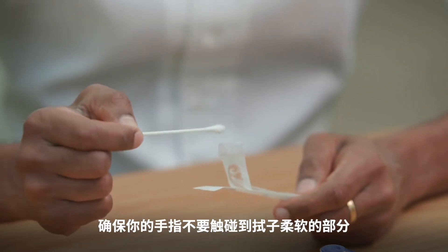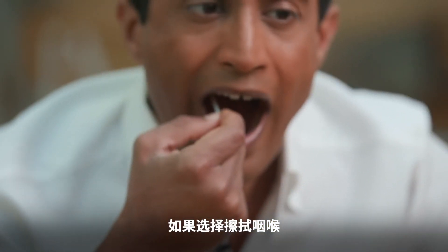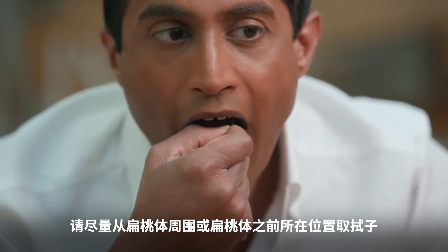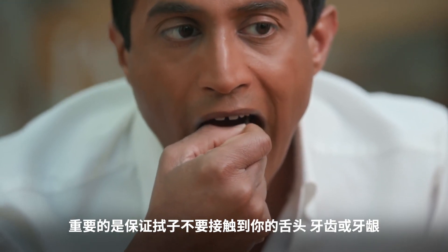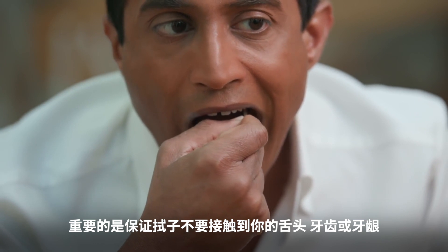You can only use the test once and only for one person. First, get set up by taking the swab — make sure you don't touch the soft part with your fingers. Then take the swab from your nose or throat. For your throat, you want to try to take the swab from the area around where your tonsils are or were. It's really important that the swab doesn't touch your tongue, your teeth, or your gums.